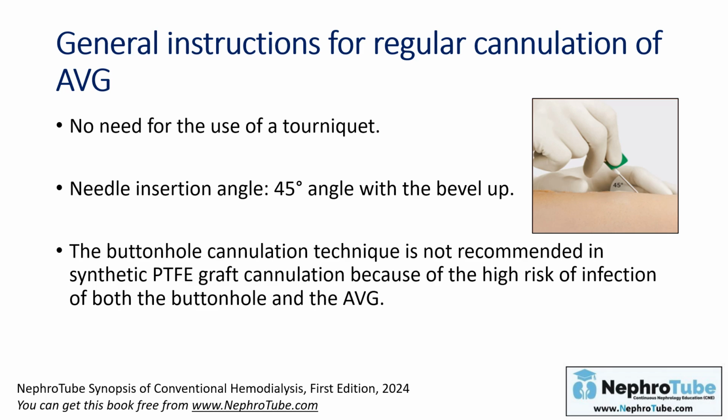The buttonhole technique that we mentioned with the AVF shouldn't be used with the AV graft, because the buttonhole technique itself carries risk of infection, and also the risk of infection is high in the AV graft, as we will mention in the next lecture. So it's better to avoid the buttonhole technique in patients with PTFE grafts. However, it was mentioned in some references that the use of buttonhole technique can be used in other materials of AV graft, but actually other materials are not commonly used. So it's better to avoid the buttonhole with the AV graft.